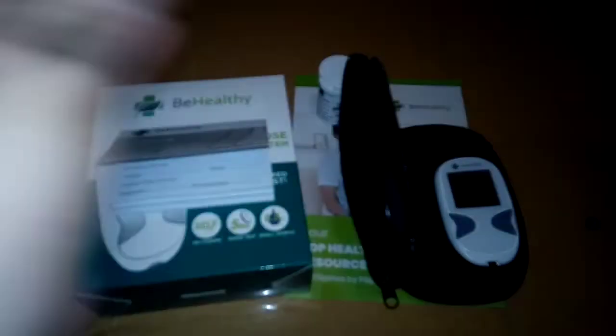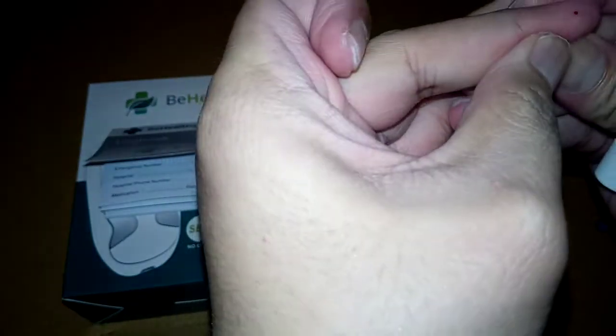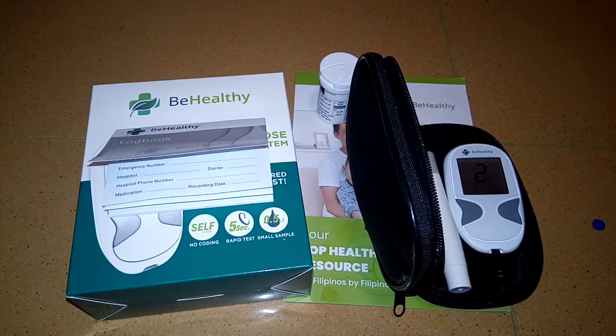Make sure you get a sufficient amount of blood sample. The machine gives a result in just five seconds, which is faster compared to other devices that take eight seconds or more.